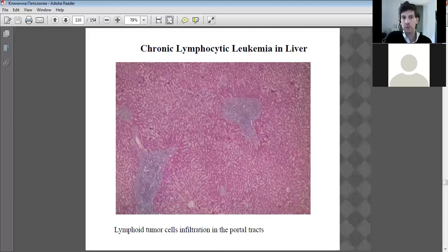It's spreading everywhere. You see the pockets there, the top there, they're all over, spreading there. So it's becoming tumors. At first it's not, but then it starts to become tumors. Eventually what's going to happen is you're going to find necrosis.